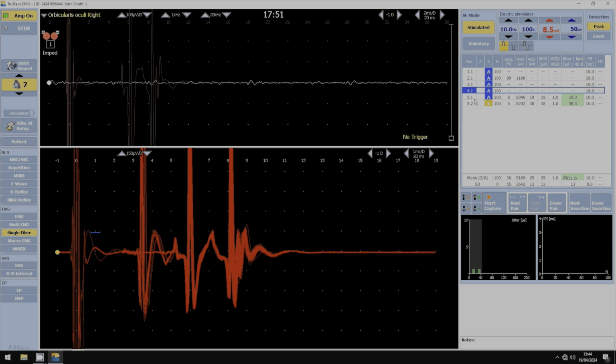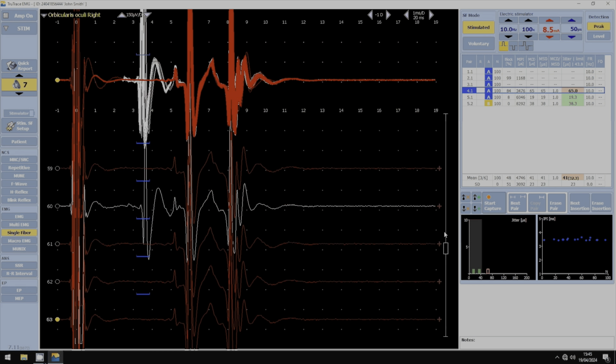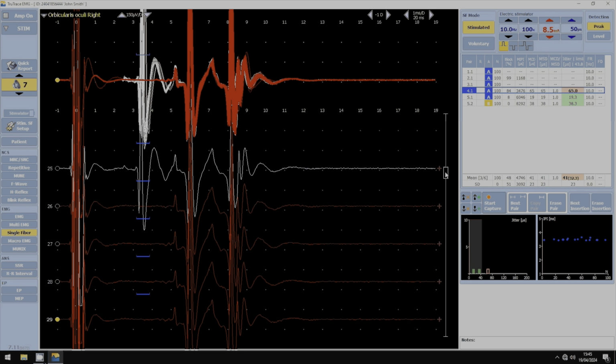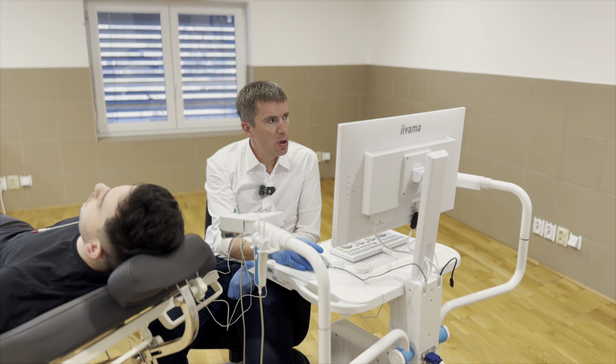If we go to number 4, again we see some beautiful pairs. We put the cursor on the first pair. We see that a couple of them have been blocked, although we have nice answers that are recorded. But 84% are blocked. Let's check. I see indeed that this muscle fiber is not correctly responding to all my stimulations. And this not responding is not because the muscle fiber is blocked, but because the stimulation is probably too low for this muscle fiber. I will not consider it as a block or as an abnormal pair.